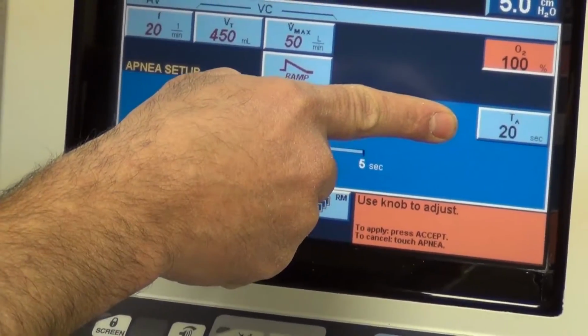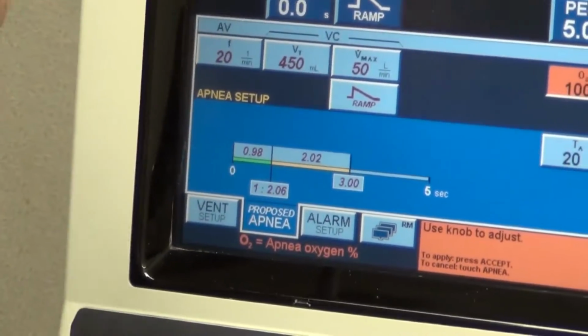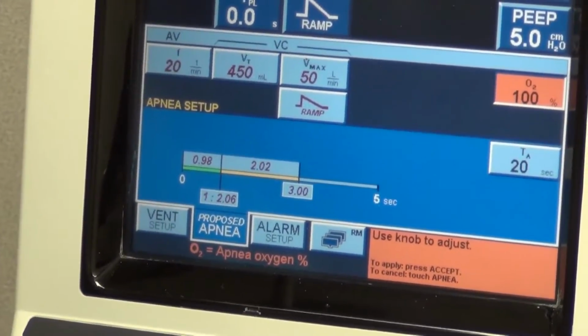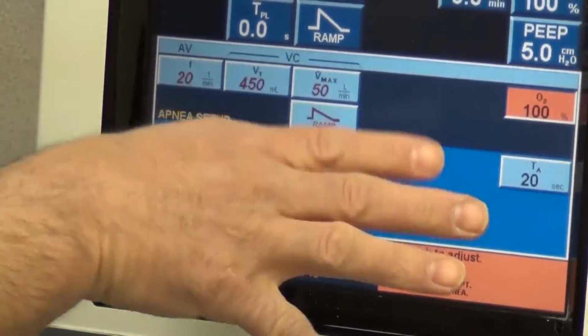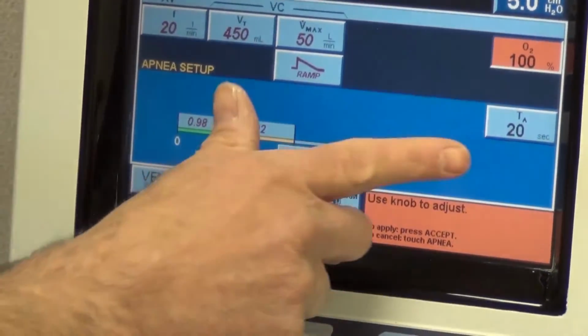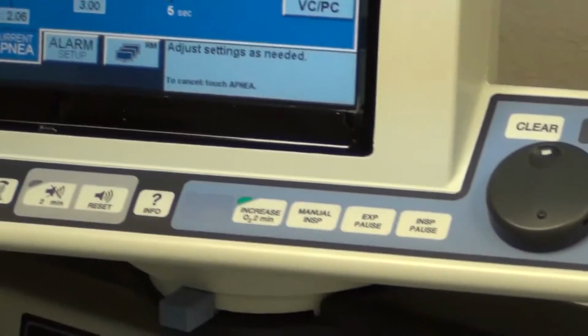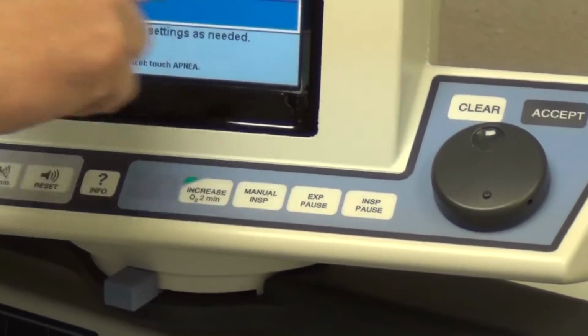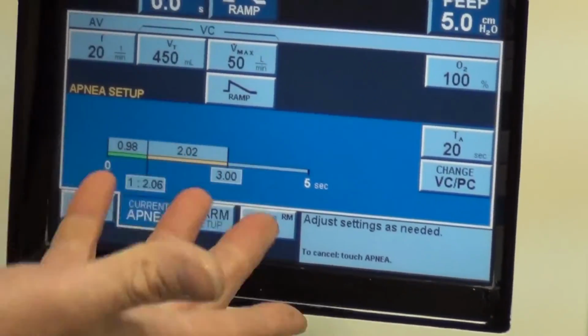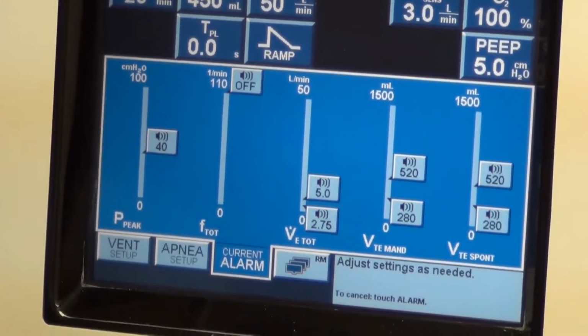This little one down here just says 20 seconds. That's if the patient doesn't breathe for 20 seconds, the ventilator will go into apnea ventilation, which is this mode right here. So that stays at 20 seconds. Then you hit accept, and it's set. Notice that the stuff that was in red changed to black. We know it's done.